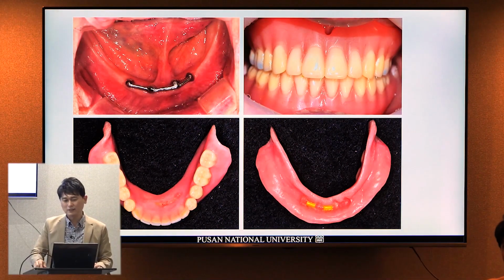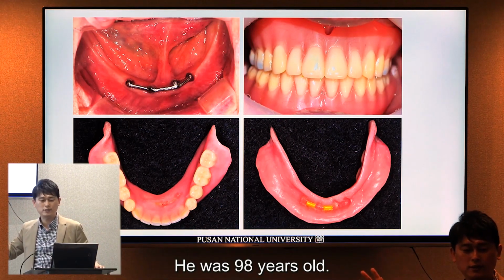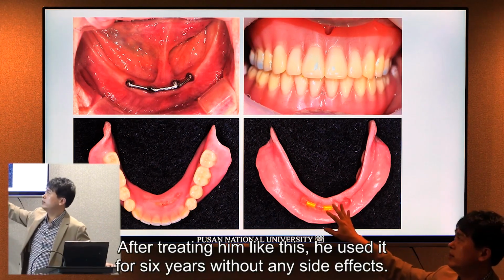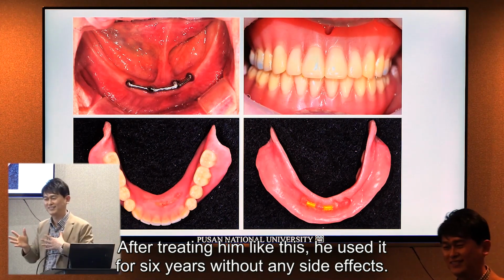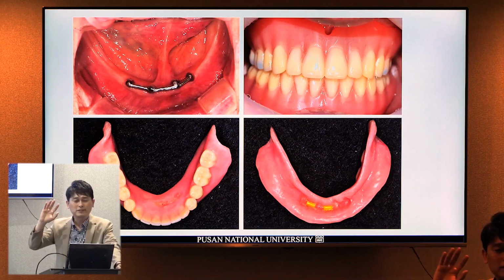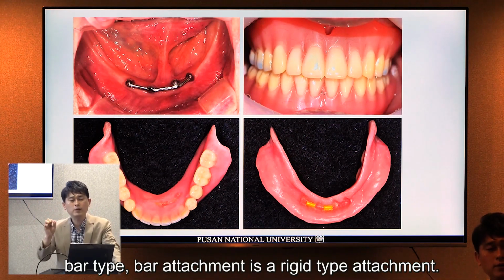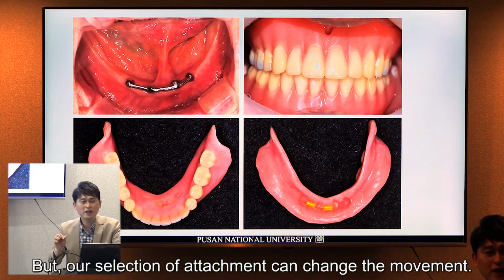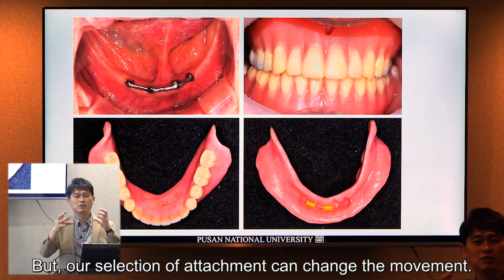So this patient passed away 2 years ago. His age was 98 years old. Anyway, after treating like this, he used it for 6 years without side effects. The reason why I showed this case is that, as I told you, bar attachment is a rigid type attachment, but sometimes our selection of attachment can change the movement.